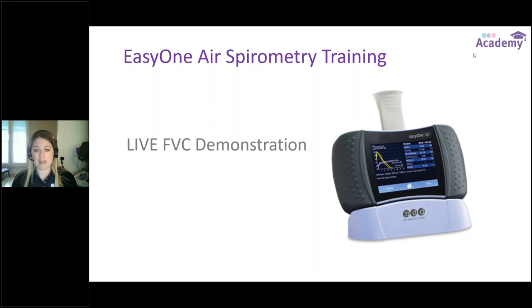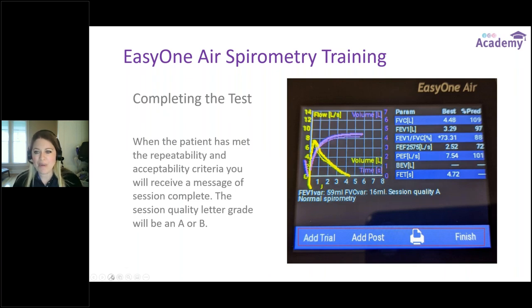On the results screen, the graphs — flow volume and volume-time curves — are on one side, with the numerical results on the other. Below the test results you'll see parameters: FEV1 and FVC, and then the session quality grade. Below that, if you've chosen to include interpretation in your reports, there will be a brief interpretation — mine is currently showing normal spirometry, based on the ATS diagnostic tree. The actual values are on the right, with session quality grade and interpretation below.